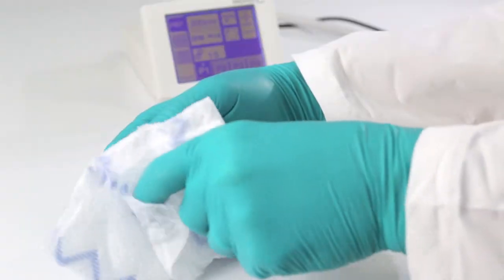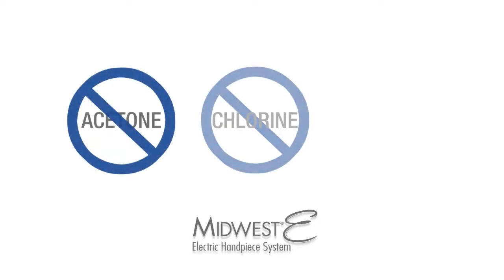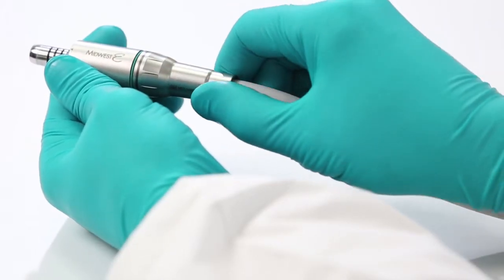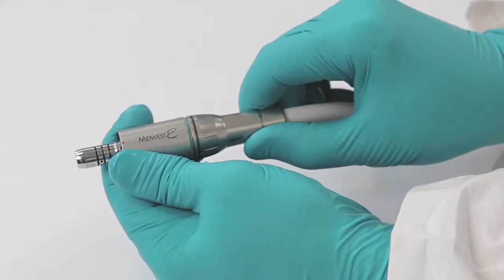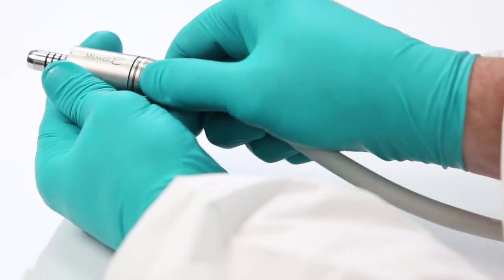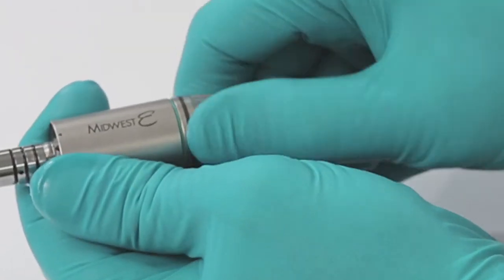To clean your Midwest E system, wipe down the hose and touch screen with an EPA-registered hospital disinfectant. Do not use cleaners with acetone, chlorine, or bleach. The motor may be removed from the hose for sterilization by turning the hose connector counterclockwise and unscrewing it. See the motor directions for use for sterilization instructions. When connecting the motor to the motor hose, ensure that it is tightened appropriately. When tightened appropriately, the colored gasket will no longer be visible.